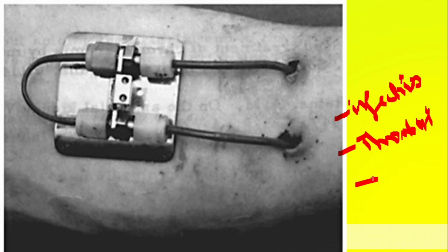But it served the purpose. What is the purpose? It served blood to the dialyzer at a particular speed. The flow was not limited. The repeated cannulation and arterial damage can be minimized.